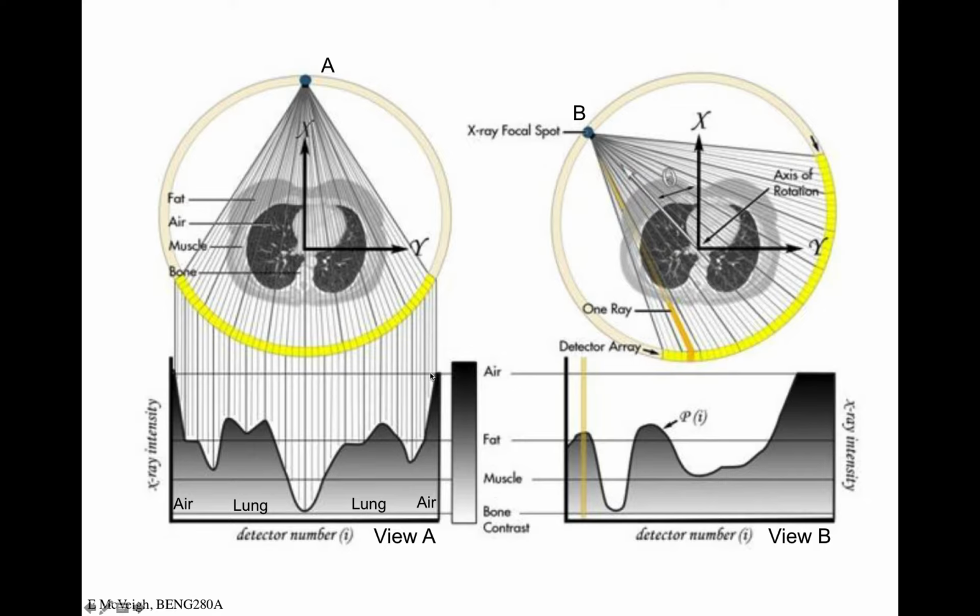These measurements actually are kind of important because what we're going to see is you really want to know what your baseline intensity from the tube is that is being shot at the patient. You want to make that measurement. And you can make it ahead of time with nothing in the scanner, right? Which they actually often do. They calibrate the scanner and see what the intensity would be if there's nothing there. Because we're really interested in the ratio of this intensity to this intensity, right?